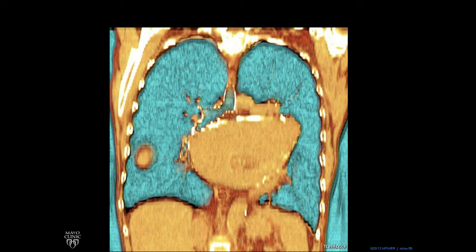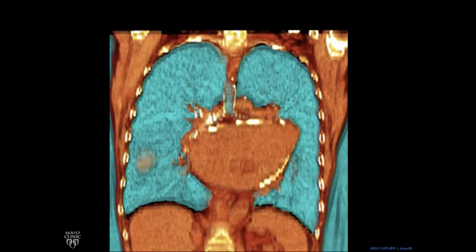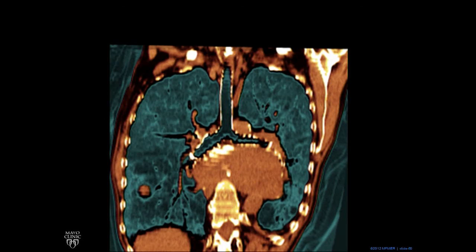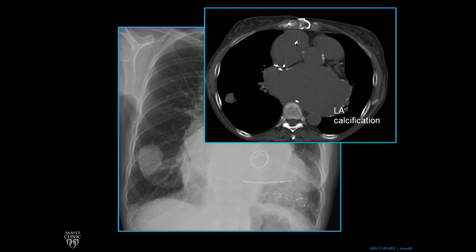We change the display a little bit — the lungs now are showing up, and you can see this rim of white which is calcification. Calcification in the periphery of the left atrium is seen in rheumatic heart disease, which this patient had. We rotate a little bit to get a better view of the trachea and the carina, and you can see that the left atrium is splaying the carina.